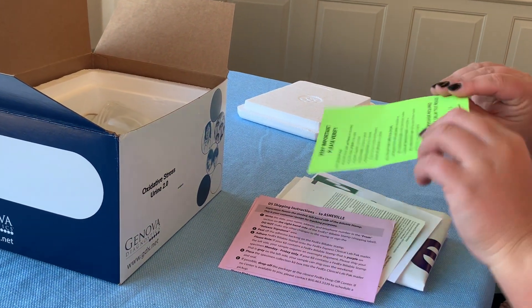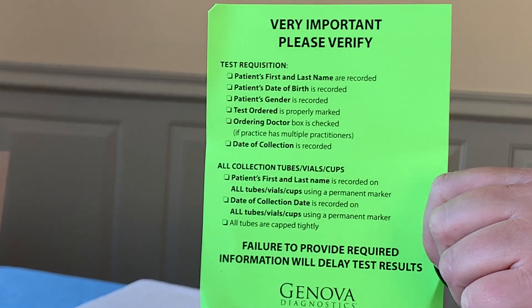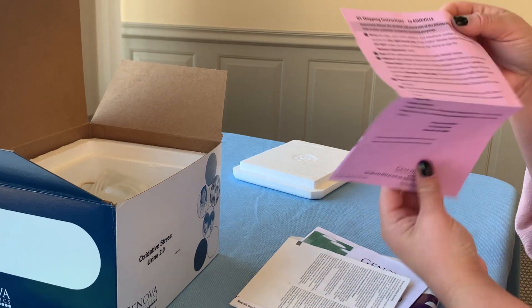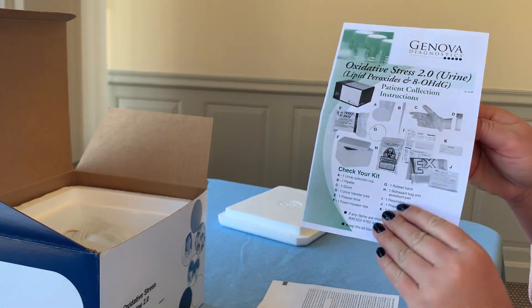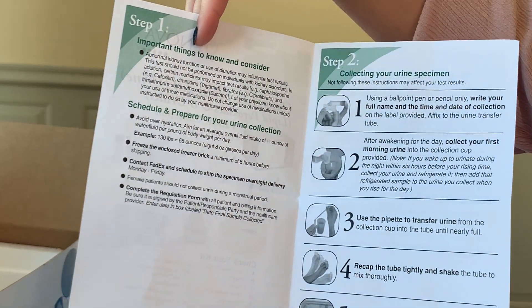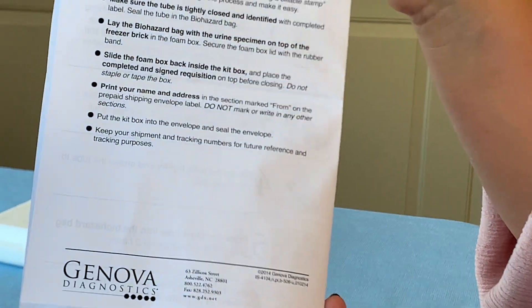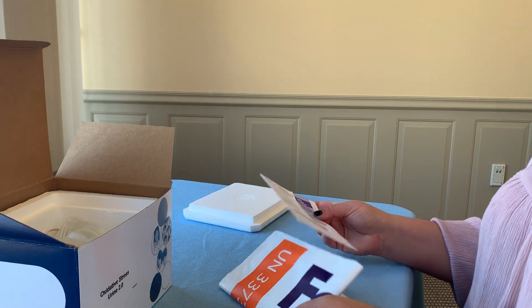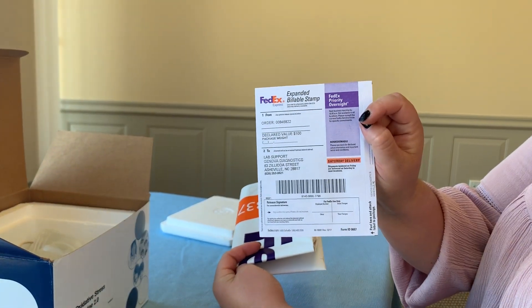The next form is the checklist — it's not mandatory, but it helps make sure you're doing everything correctly. You should also have some shipping instructions, the test instructions which tell you everything you should have, things to consider before the test, how to prepare, the five steps for the test, and shipping instructions. Definitely keep this one handy. You should also have your FedEx shipping bag and your shipping label.